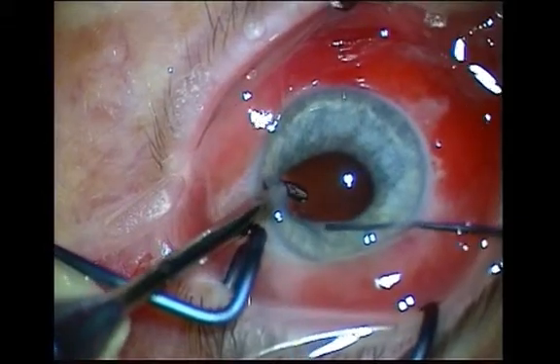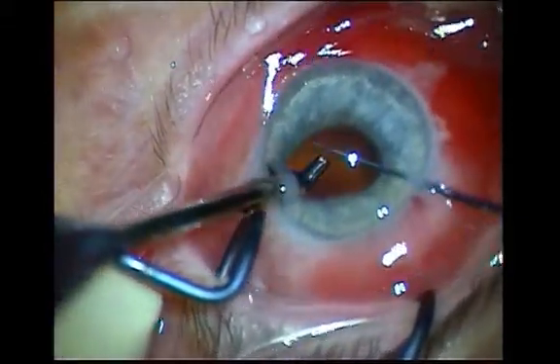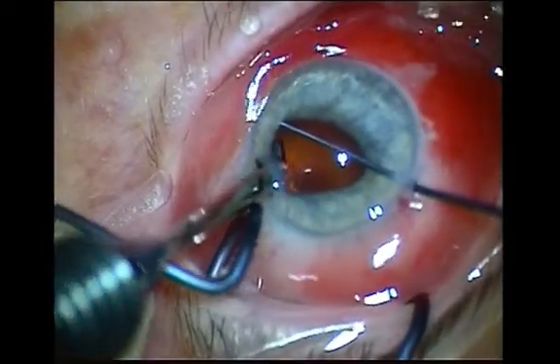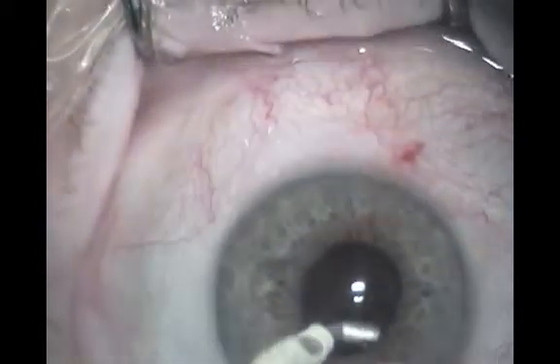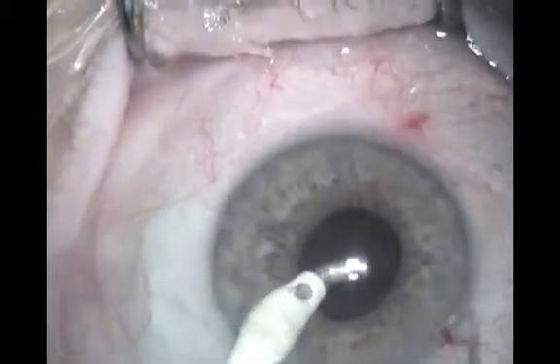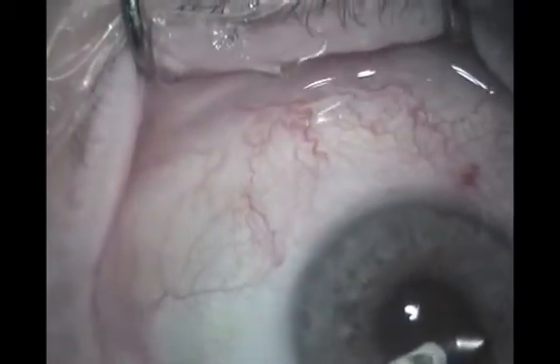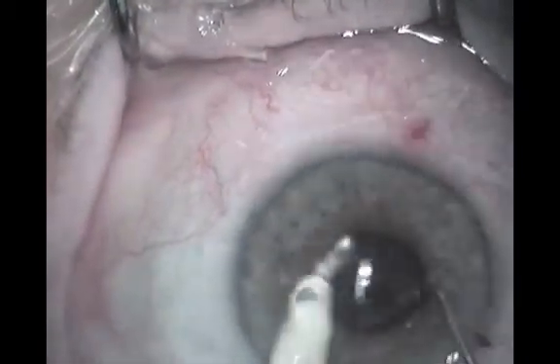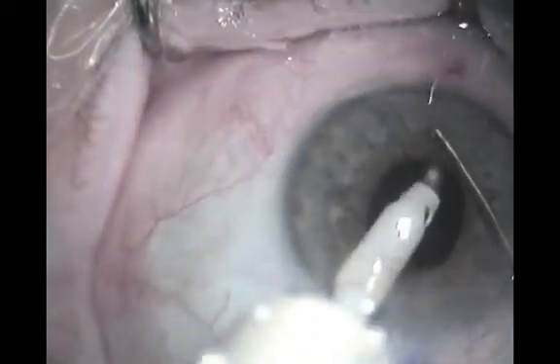With sufficient experience, the operator can sometimes blindly introduce the aspiration tip under the iris even with hidden cortex. The tip is introduced towards the internal surface of the anterior capsular edge with irrigation on to ensure the capsular bag is expanded.